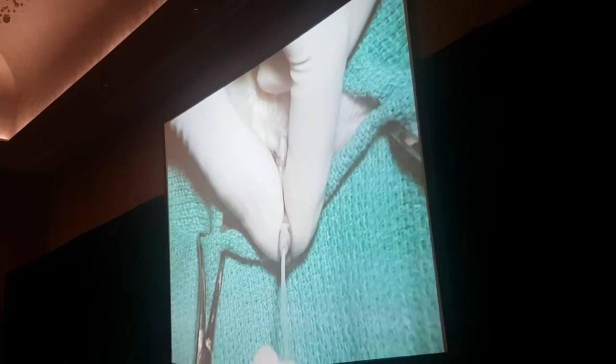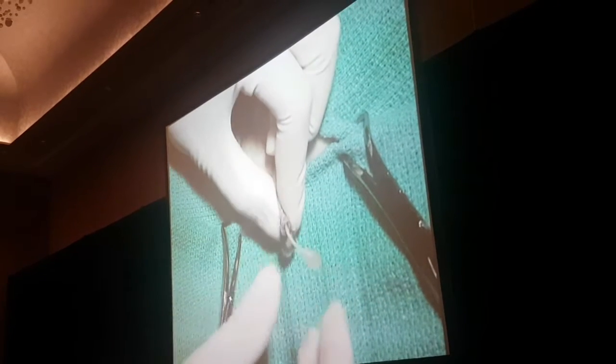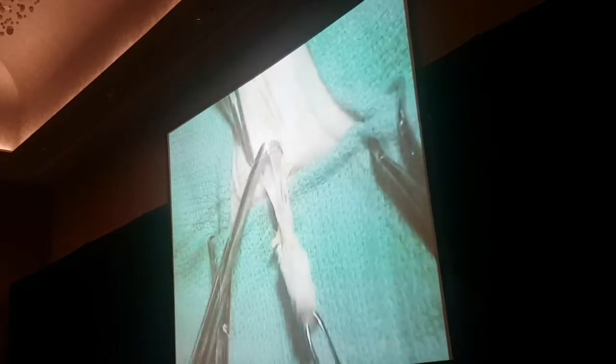I'm going to pass a catheter, and you don't have to do this at this point in the surgery. If you want to make sure you keep track of where his urethra is, it's fine.